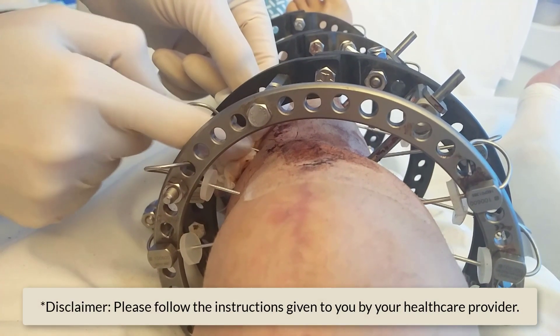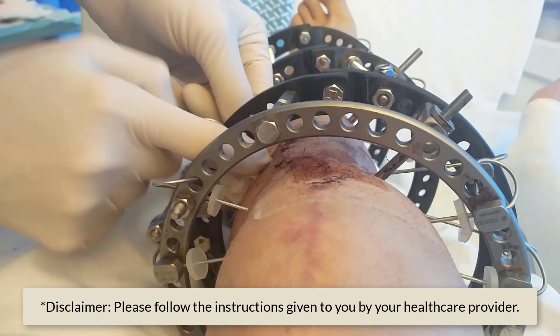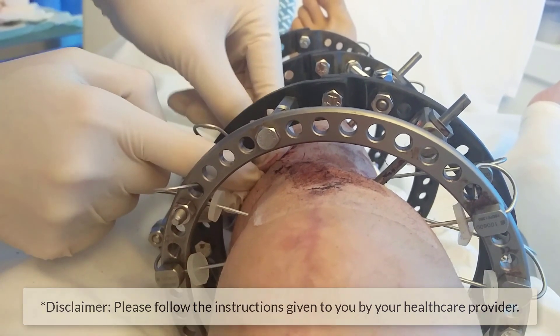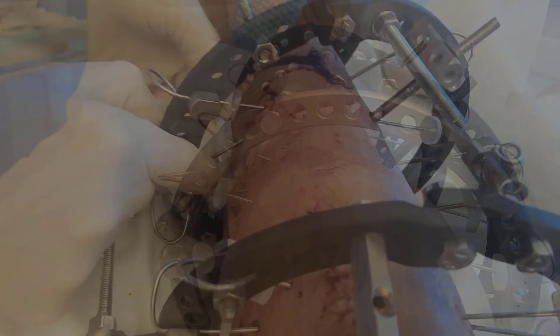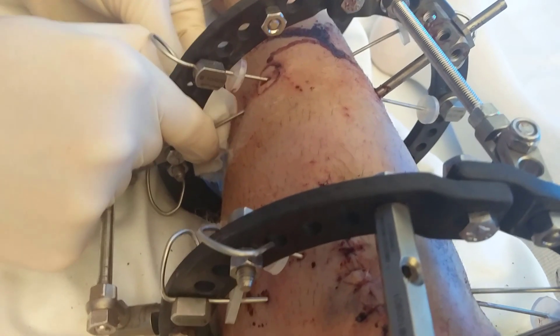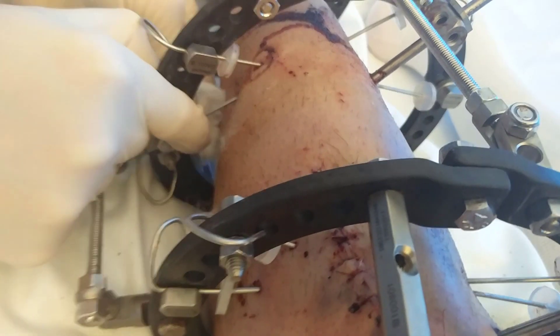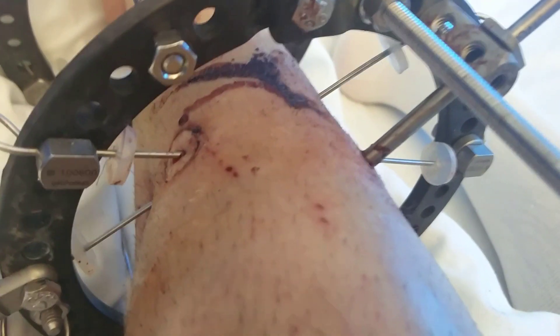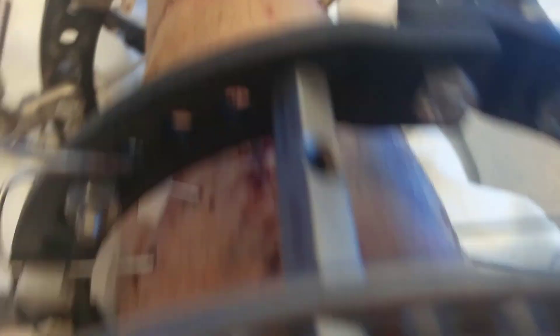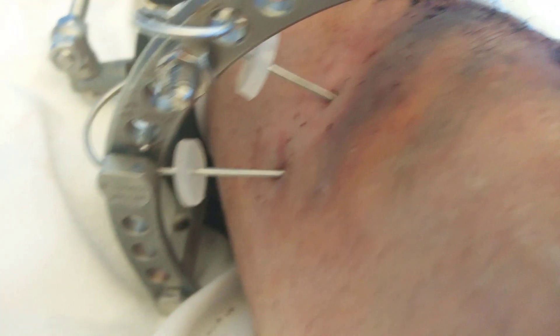It's important to keep the pin sites clean. Over the coming days you need to make sure that the pin itself, the bung — the plastic rubber thing that keeps the dressing in place — is kept clean, along with the wound entry and exit sites. In this video you can see the specialist nurse cleaning it for me for the first time, so I can learn what to do.